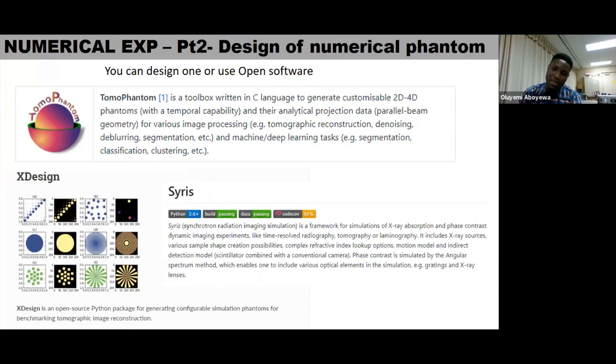I was thinking in the light that, for your dose calculation, we're using a CT number to electron density map, right? We have a conversion where we assume that this Hounsfield unit is equal to this kind of electron density. But if we have the same CT number, then we map it to technically the same material, and that may not be the case.